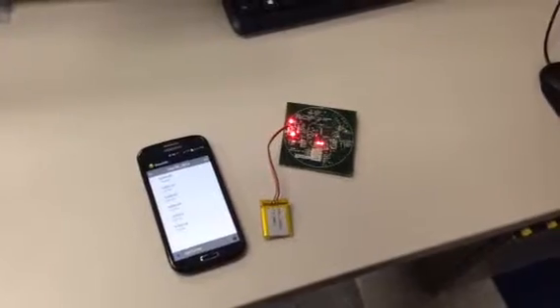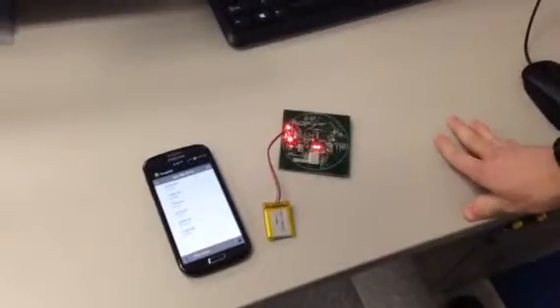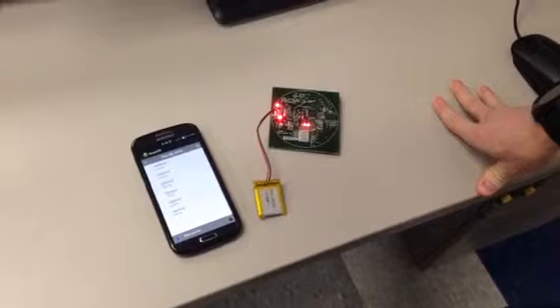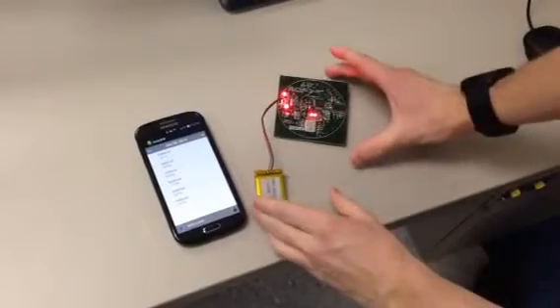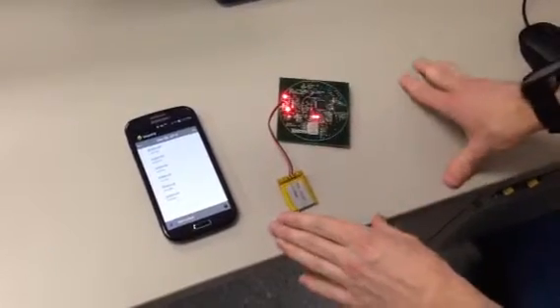All right, our project is called Smartpill, and it's a full system that will help patients keep track of their medications and also give caregivers a view of medication adherence for their patients. So our base project was this board right here, and this is essentially what a patient would affix to the top of their pill bottle.